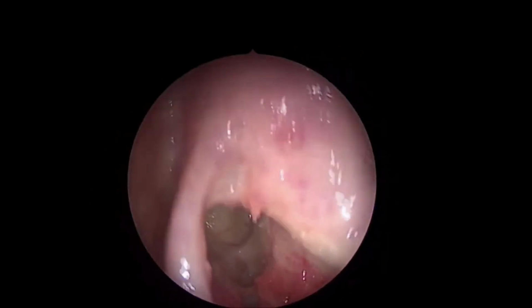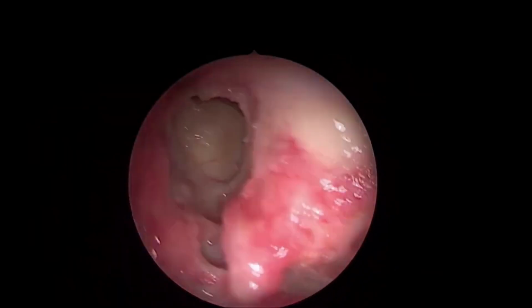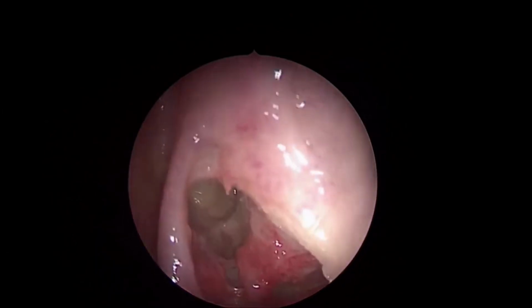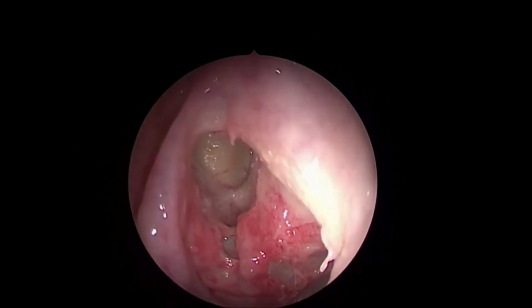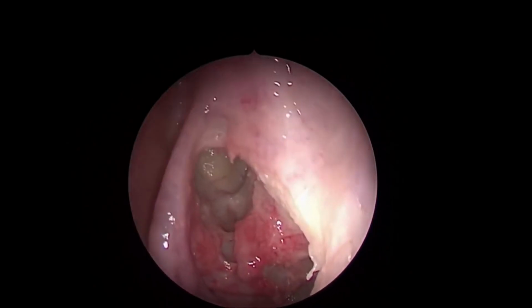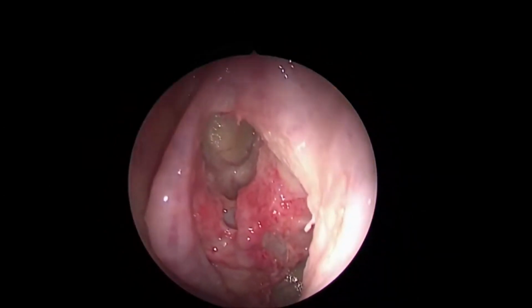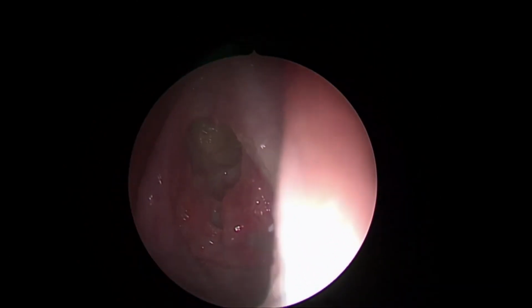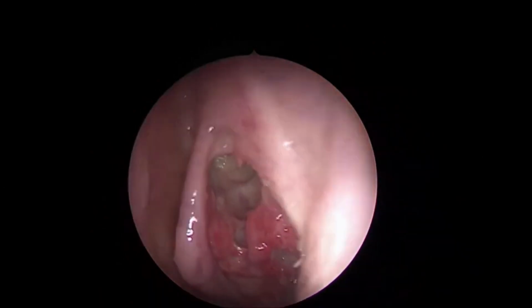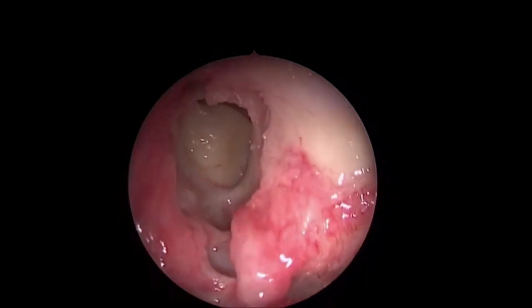If I remove this thick bone, the entire frontal sinus will be marsupialized. His technique of Draf, which he has classified into type 1, 2A, 2B, 3, we'll discuss in detail, along with a lot of other modifications to the Draf procedures. These Draf procedures are the endoscopic version of what Lothrop described more than 100 years ago. The same marsupialization of the frontal sinus, but from outside, which now we can do endoscopically. That's why we call it the endoscopic modified Lothrop procedure, or Draf 3, which Lothrop had described more than 100 years ago from outside, the same procedure.